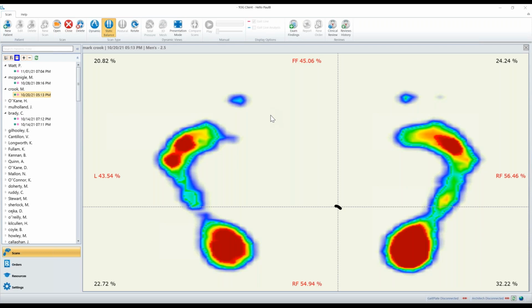So if you see 100 patients in a week and you bring them in and you just scan them all and show them the static scan, not discussing orthotics straight away, this patient is booked in, or should be booked in, for an appointment for an investigation to see why they've no toes hitting the mat.